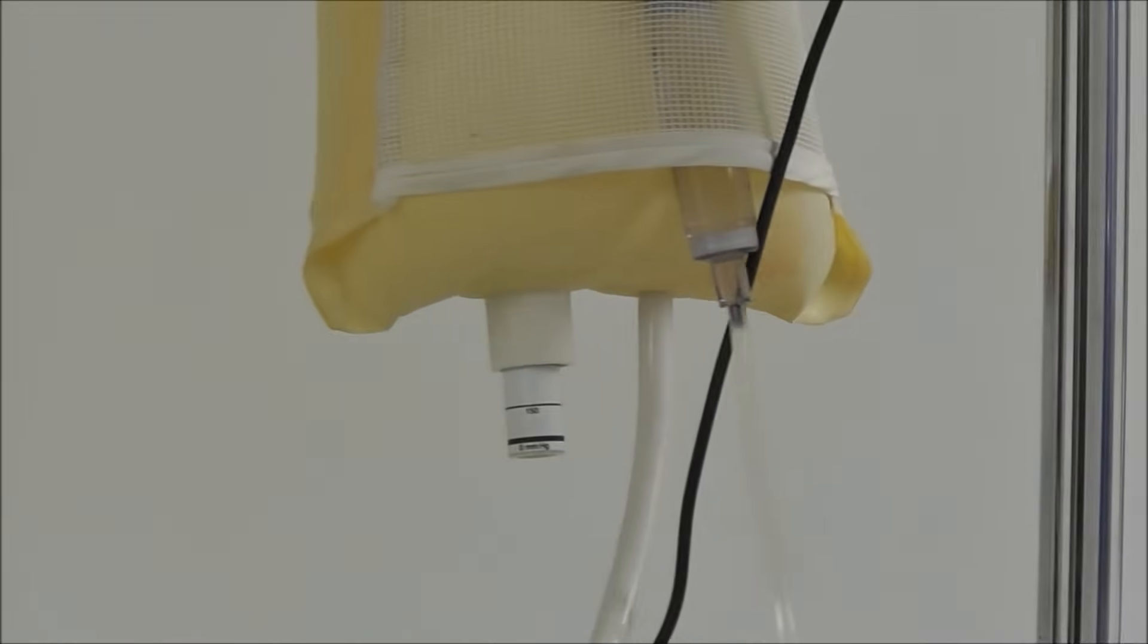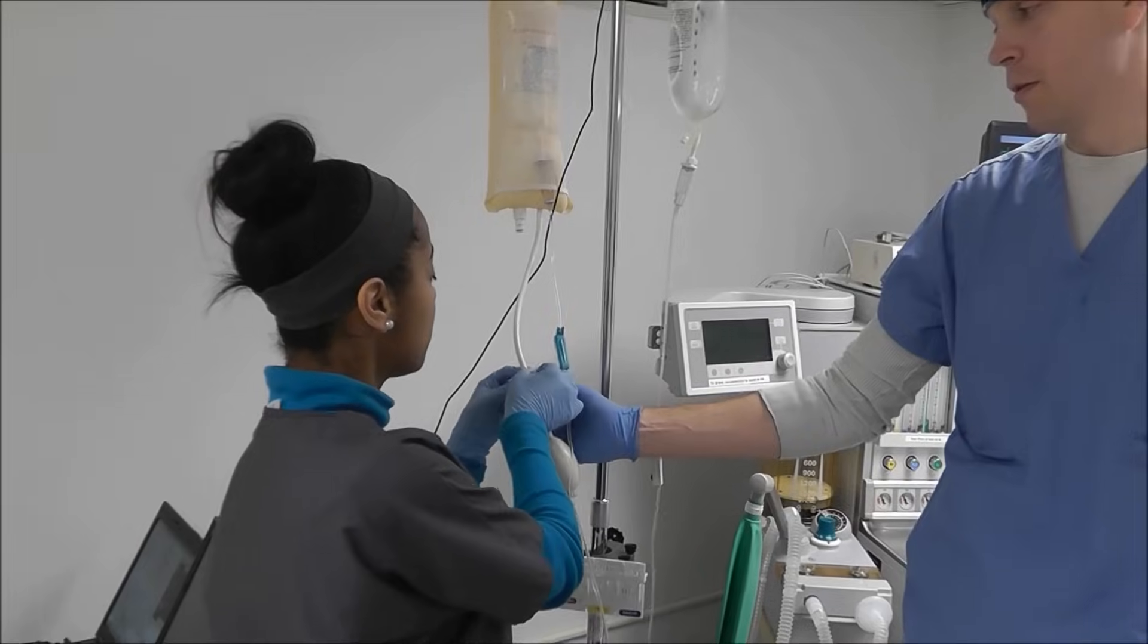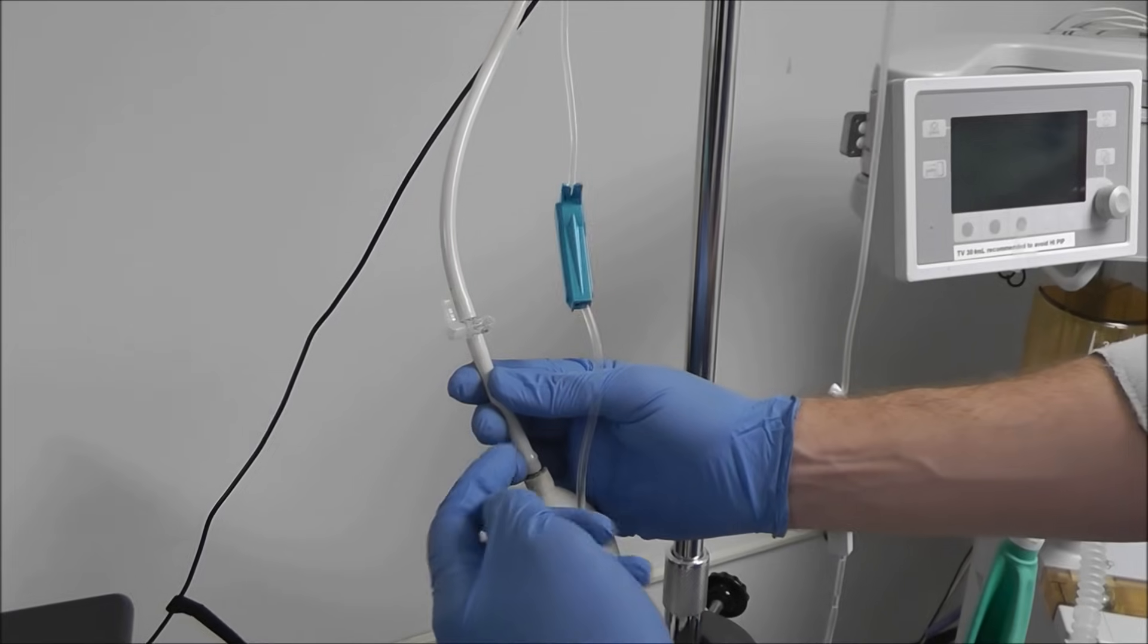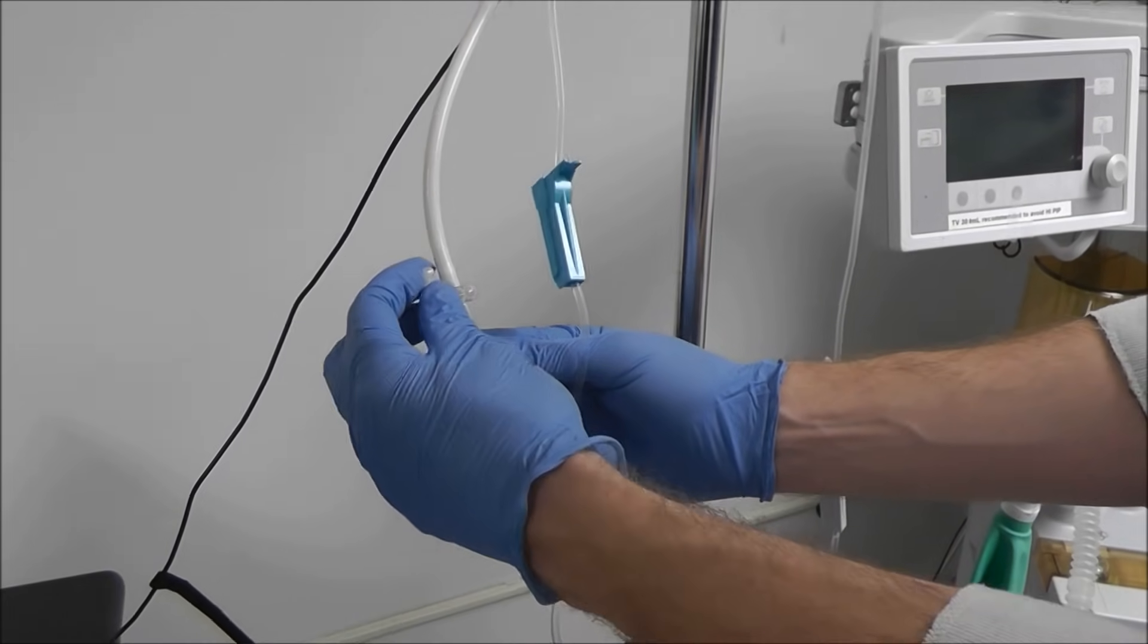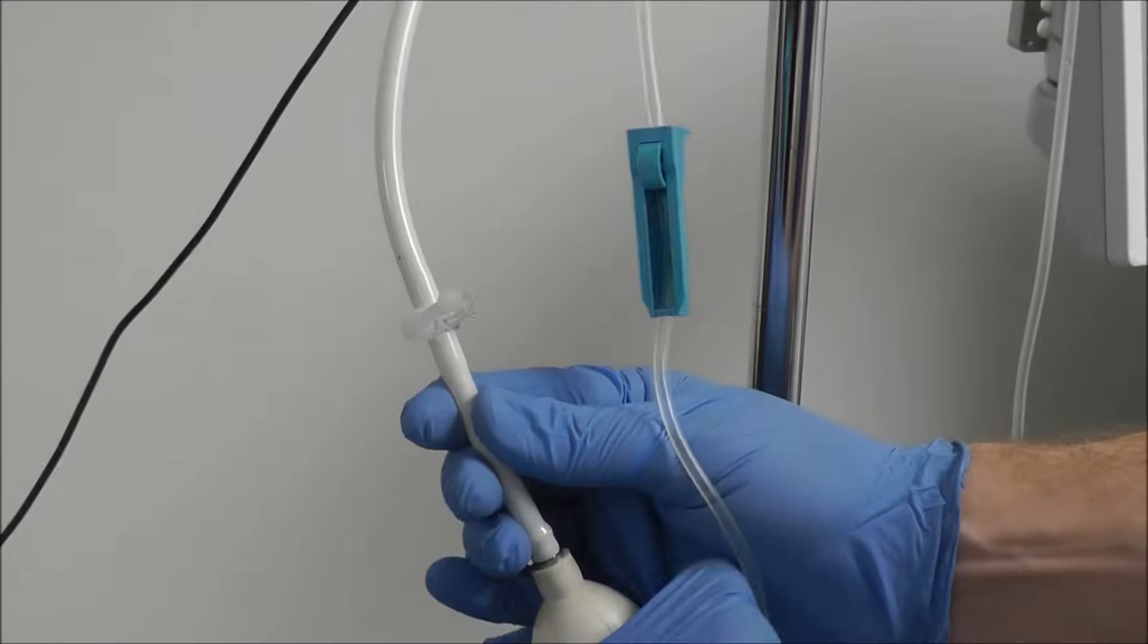And then once we're done, if we see the stop cock, where does that need to be when we're done? You want to turn this towards the bag. That allows no air to escape out. When we want to take the pressure out, we just simply turn the stop cock down. But I don't want to lose my pressure.